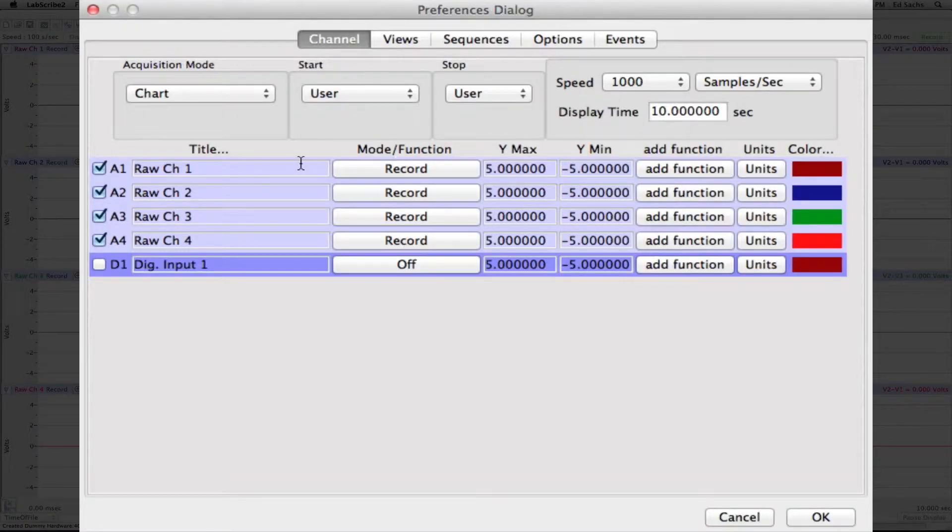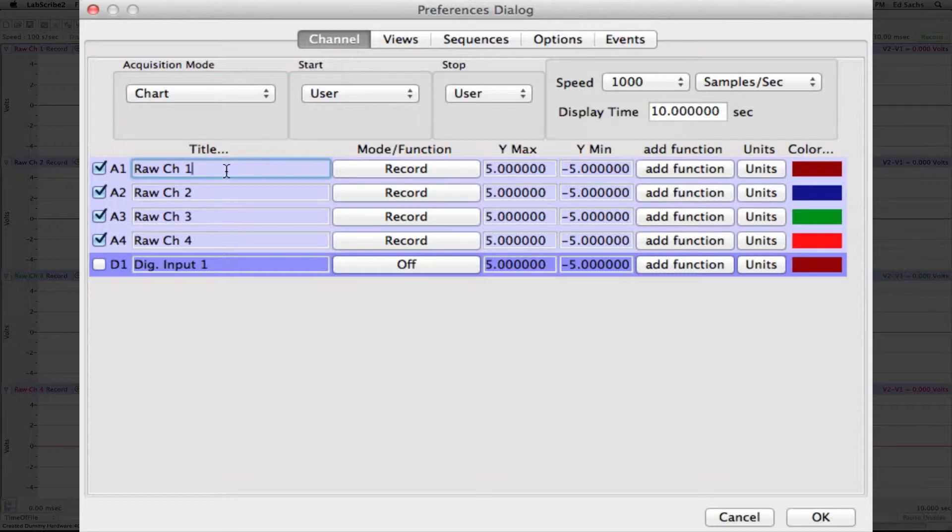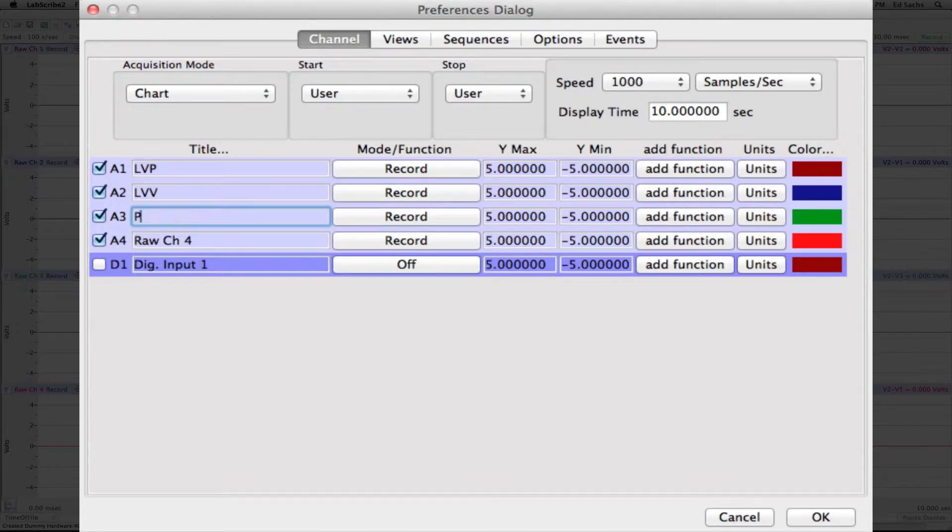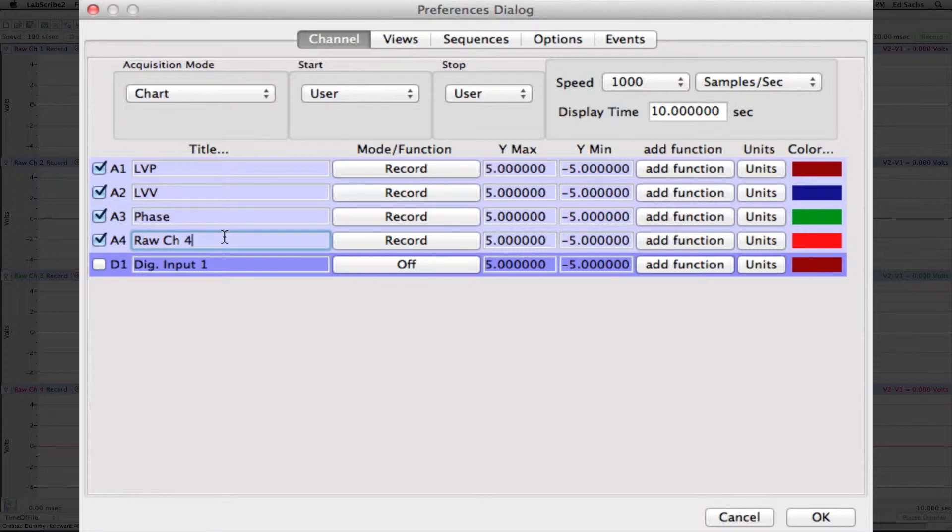Then we'll change the channel names. Channel 1 should be the left ventricular pressure. Channel 2 will be the left ventricular volume. Channel 3 will be the phase. And Channel 4 will be the magnitude.